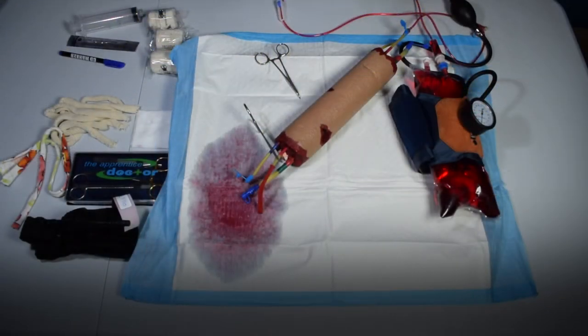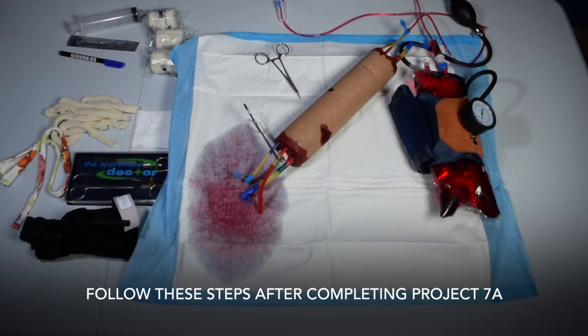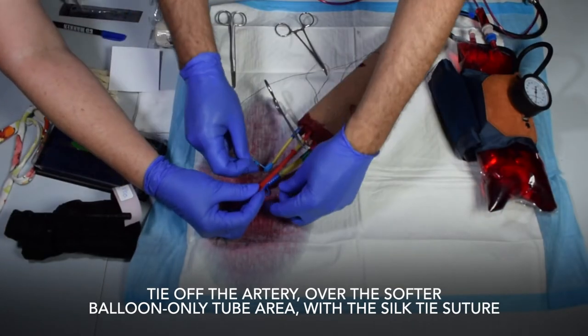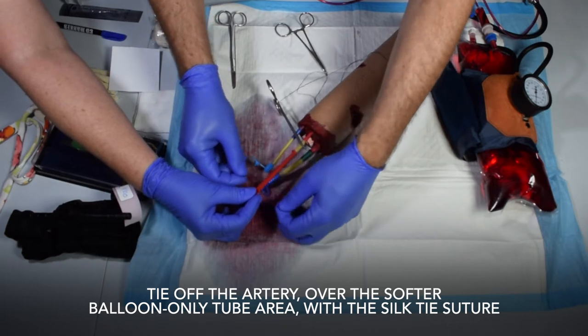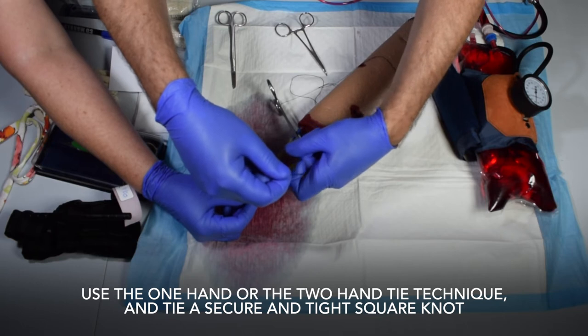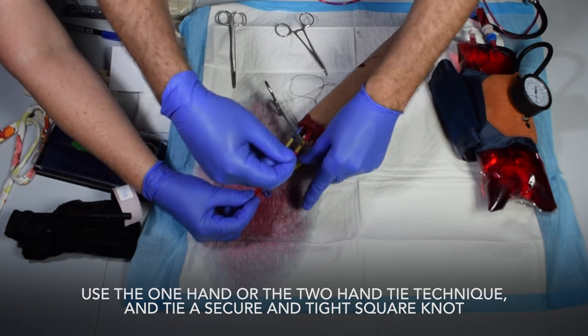silk suture. Follow these steps after completing Project 7A. Tie off the artery over the softer balloon-only tube area with a silk tie suture. Use the one-hand or the two-hand tie technique and tie a secure and tight square knot.